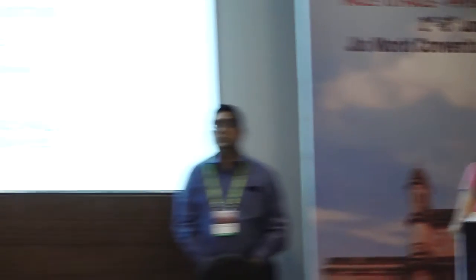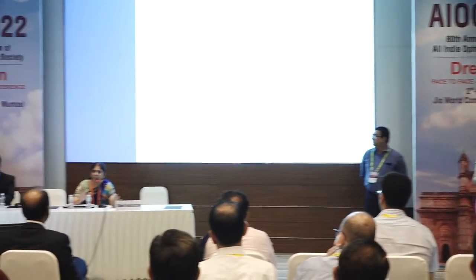So the recommendation is to go for a higher cut rate but low vacuum. Whatever your machine allows, go highest in that machine. But vacuum has to be low. That's the main thing for vitrectomy, which will be higher for cortex aspiration.